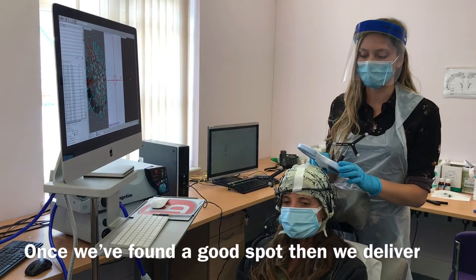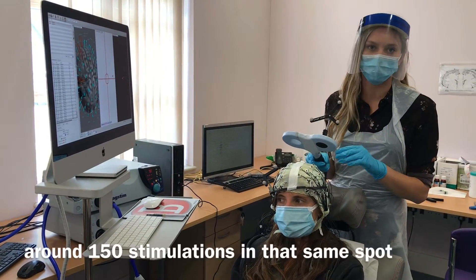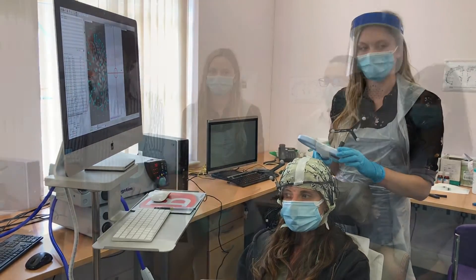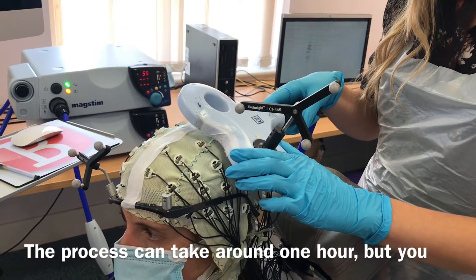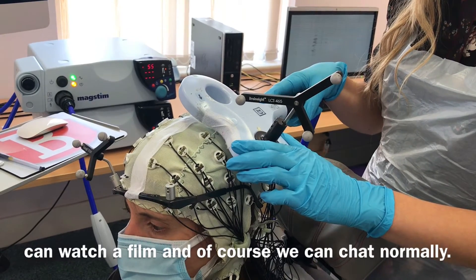Once we've found a good spot, we deliver around 150 stimulations in that same spot, which just takes about 10 minutes. The whole process could take around one hour, but we normally allow people to watch a film and, of course, we can chat normally.